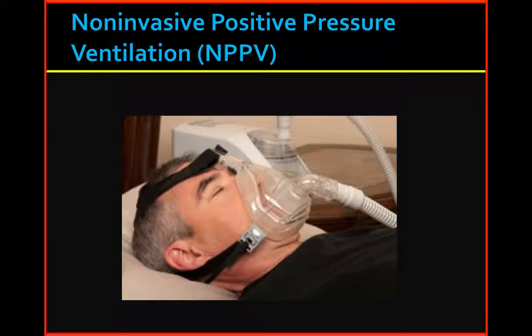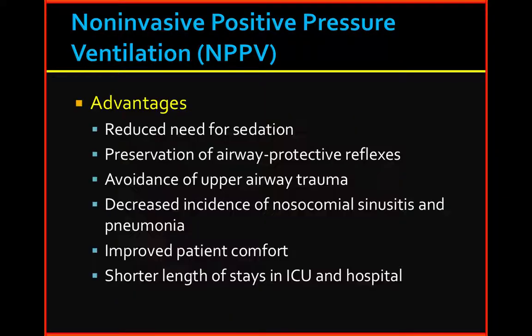Advantages of the non-invasive positive pressure: it reduces the need for sedation, preserves the airway protective reflexes, decreases the incidence of nosocomial sinusitis and pneumonia, and increases patient comfort compared to having an ET tube in. This is all compared to the ET tube, and there are shorter lengths of stay in the ICU and hospital when you can get away with just using these for oxygen.